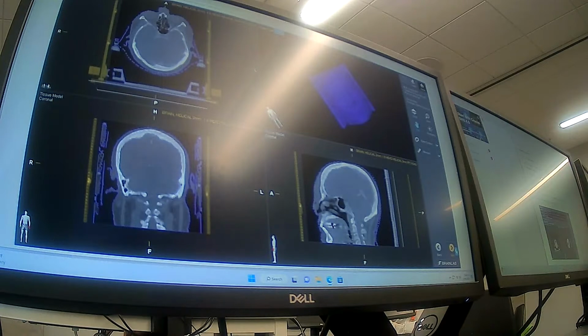I thought, when I was in Oregon for a friend's site visit, they said there was one site that was still using paper templates printed off an inkjet printer to put on there for the localized isocenters, which is shocking. Really? Because can't most machines today just have their own isodose lines? Well, positioning, you do everything. Right? But they were actually just lining up lasers to X's on the printout. Okay. Yeah, it's shocking, but that stuff does exist.